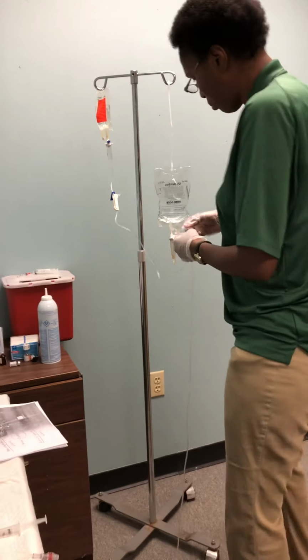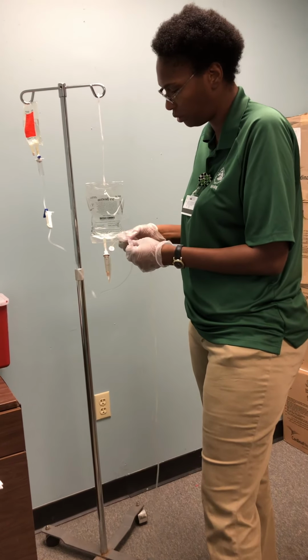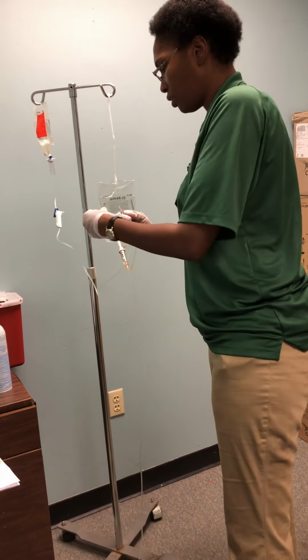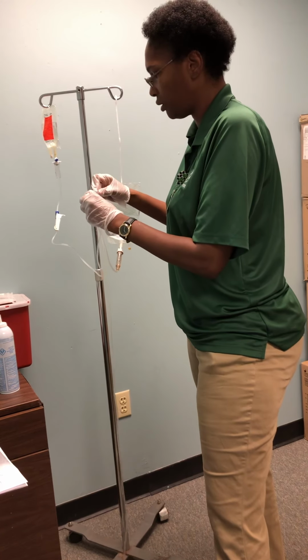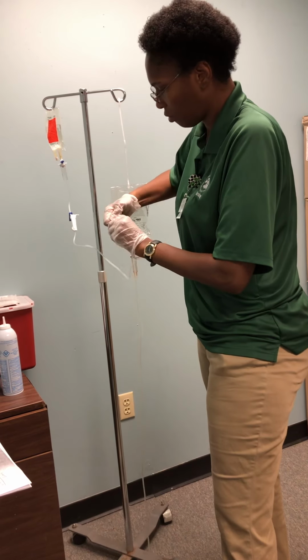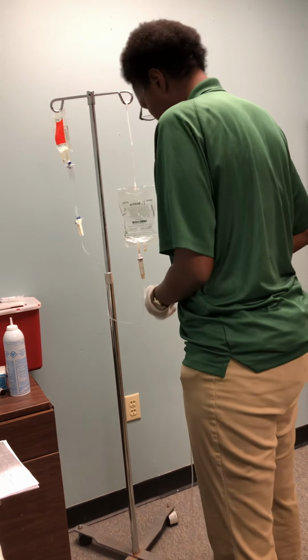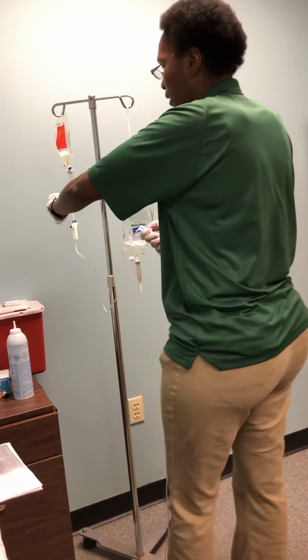I'm going to clean the port closest to the primary bag for 60 seconds. Connect my piggyback. And I will open the piggyback. Calculate my flow rate of 17 drops per minute.